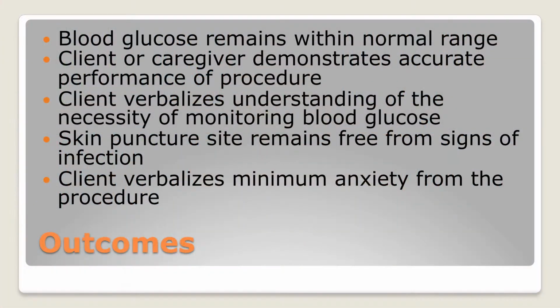If a patient doesn't understand why they're doing something and the value of it, they're not going to continue to do it. And you want to make sure that your puncture site, you did just make a hole in the integument, so you do want to make sure that they remain free from infection and that the client expresses that they're not as anxious about the procedure, that they're becoming more accustomed to it.